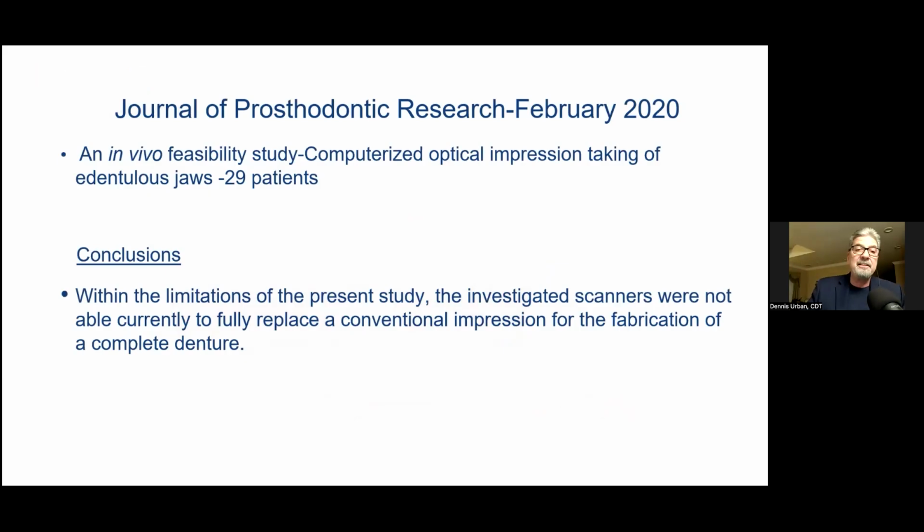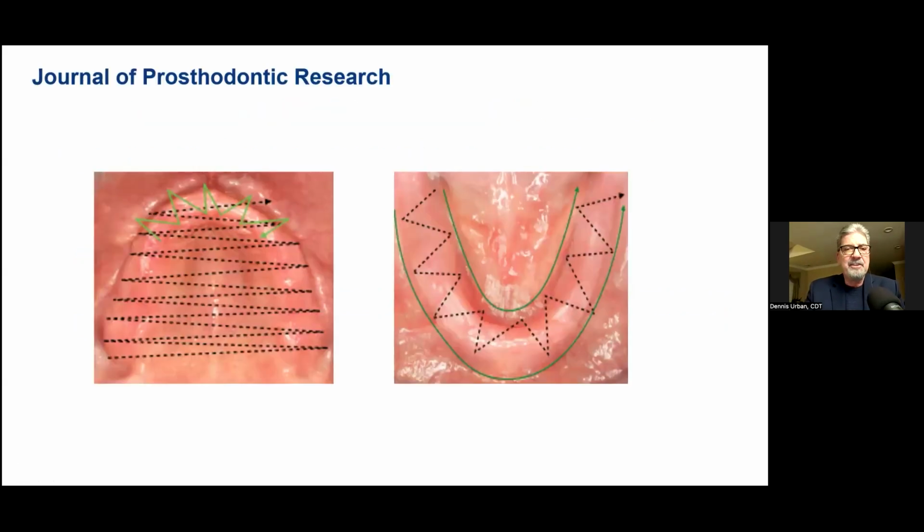There was a study done in the Journal of Prosthodontic Research in February 2020, where they did an in vivo feasibility study on computerized optical impression taking of 29 fully edentulous patients. Their conclusion was, within the limitations of the present study, the investigative scanners were not able to fully replace a conventional impression. But you know what? If you look at the scan strategy and the directional scanning they did, it was totally different than Dr. LaRusso's. They're kind of going zigzag across the ridges.